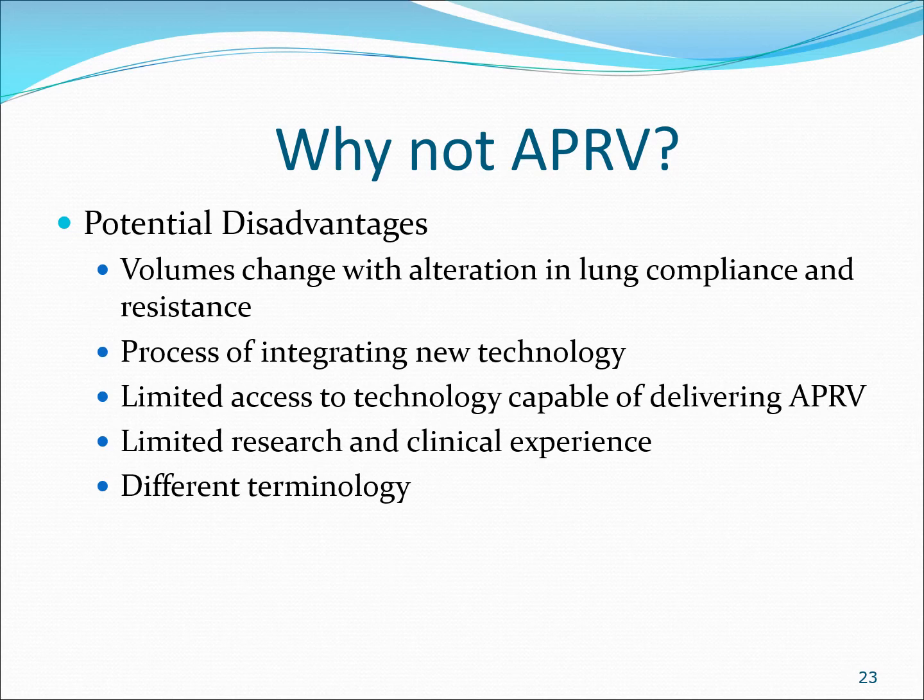I've never worked with a Hamilton DualPAP. Would I understand the concept? Absolutely. I would understand it clearly. But I don't know the terminology. So the fact that we've got so many different names for the same thing makes it confusing to the clinician.